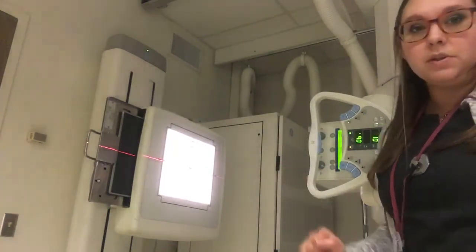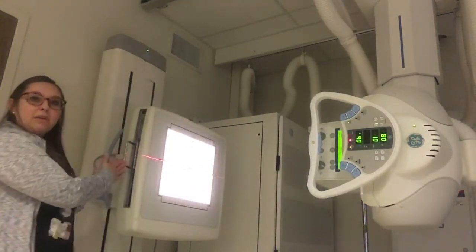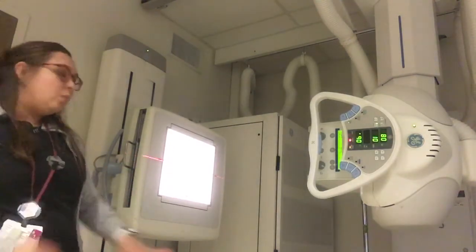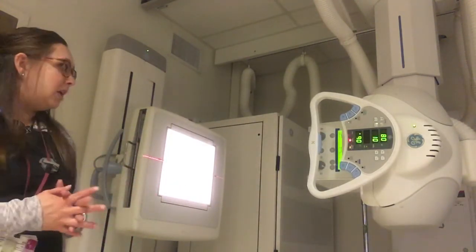Then we would close the bucky drawer again. This always has to be closed, because if we line everything up — the tube and the bucky — we have our image receptor inside and everything's lined up. Then when we use our central ray placement, which will be right here on the patient, it's going to be all included inside that viewing area.